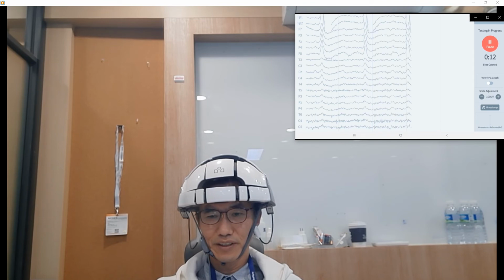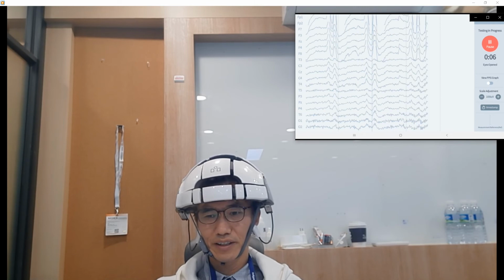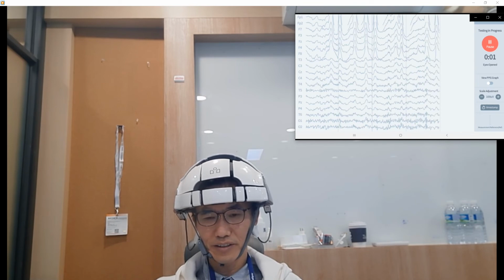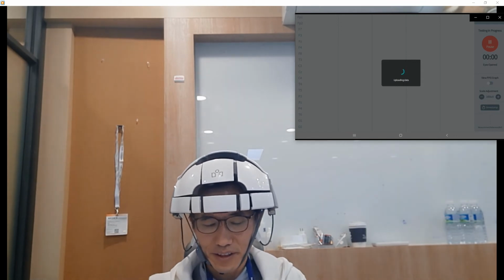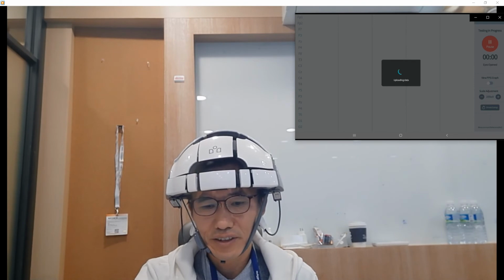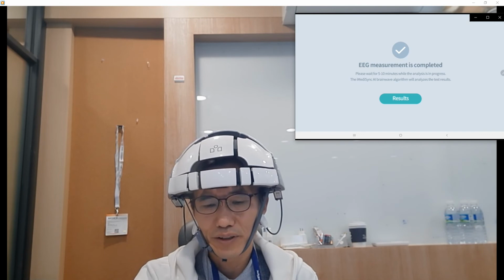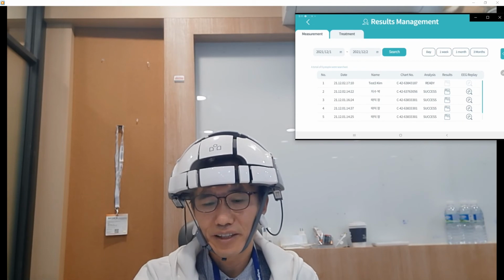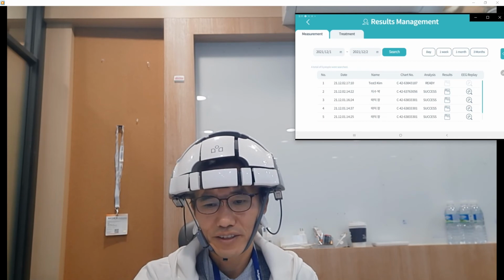This is the brief EEG recording process guide video, and the measurement is completed. After the 2-minute eyes closed and 2-minute eyes open recording, the data is uploaded to the cloud, and then you can find the result page. In this case, the result is not activated, but after a few minutes, you can review the EEG signal monitoring, and within 10 minutes, you can find the results.